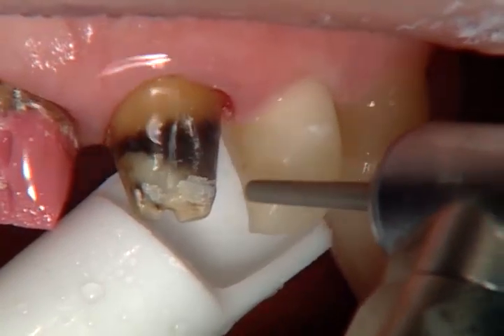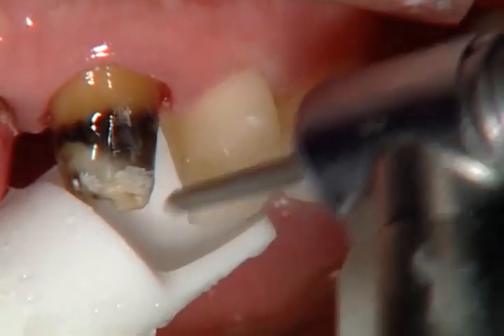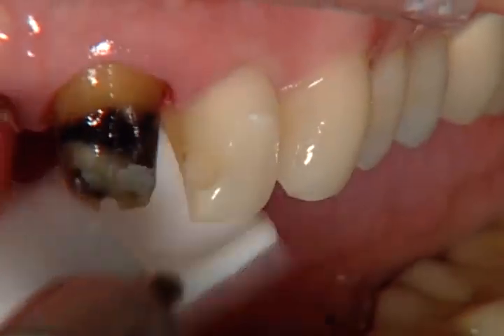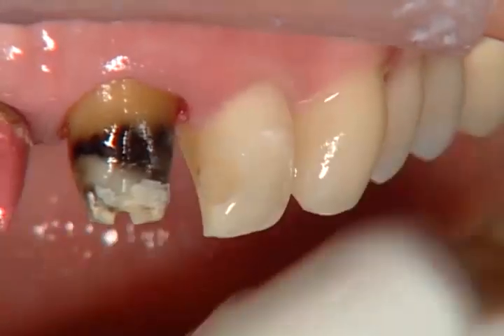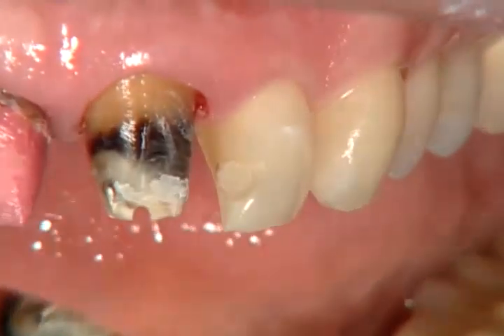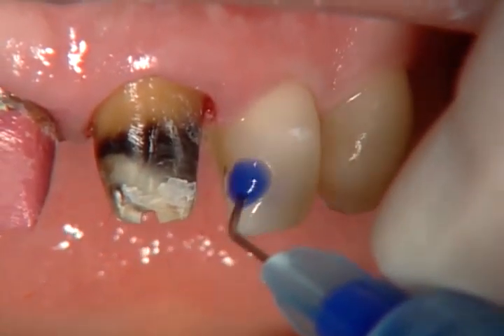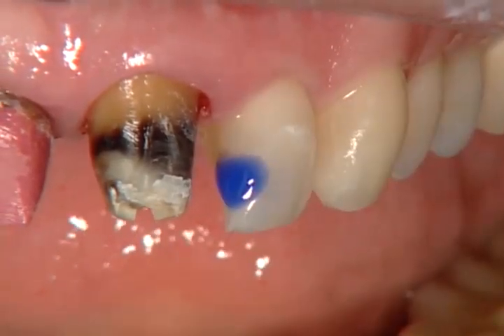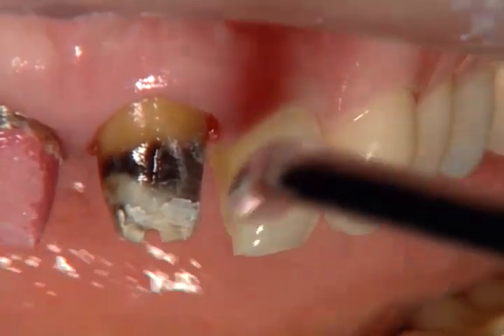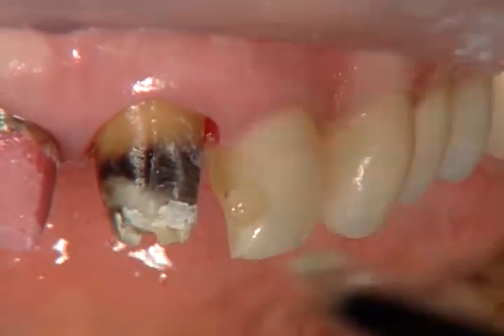So rather than remove the whole thing and take it all the way down to the dentin, I'm resurfacing this composite by removing about 3/4 of a millimeter of it and then extending a bevel out from where it was before. It was prepared before perfectly round, and you can see the bevel that I've put there. It goes from thick to thin as it kind of feathers out. And this allows for the most natural transition between composite and tooth. If you prepare just a round hole into the tooth, it's pretty easy to see where the composite and the tooth come together. But if we prepare something like that, almost like a chamfer, it's essentially like putting a chamfer that tapers to a feather edge on the side of a composite so that the composite gets thinner and thinner and the tooth shows through more and more as we move out. So this is certainly the best way to put a direct composite into place and be able to disguise it.